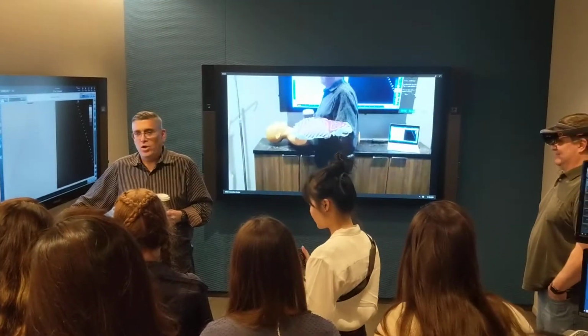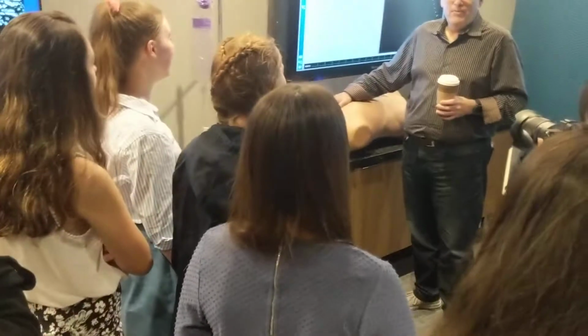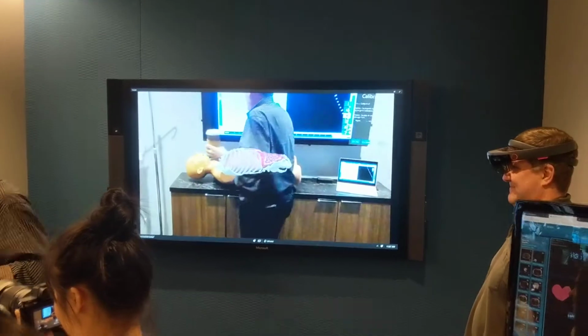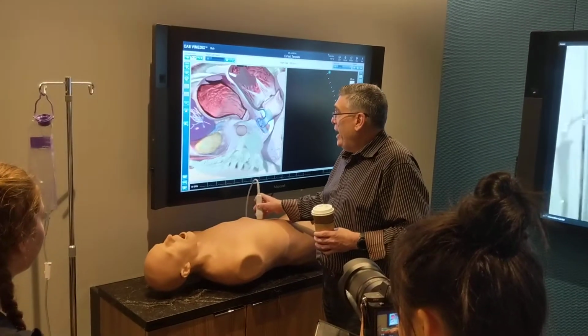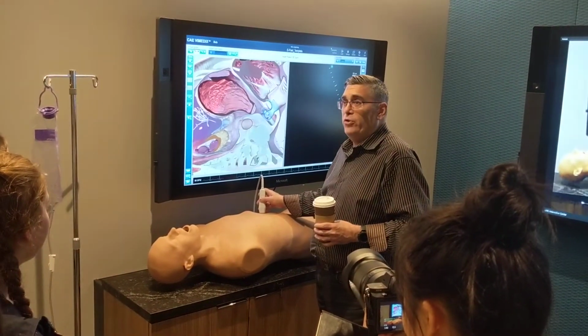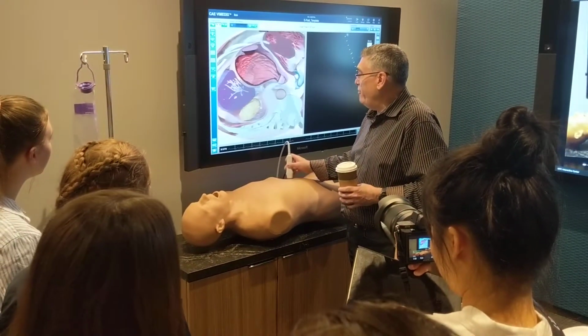And then the team decided to call him Smart Bob. So I didn't know if I should take that personally or not. But so this is Smart Bob. What's that make me? I don't know. But this is a teaching device for nurses and doctors, people in the medical industry. And this is obviously using technology on the Windows platform for doing three-dimensional rendering in this 2D format.